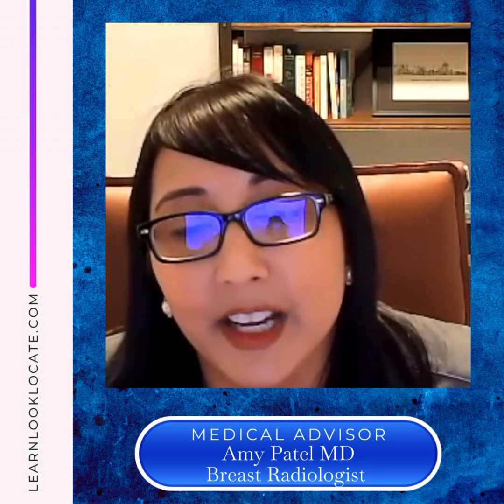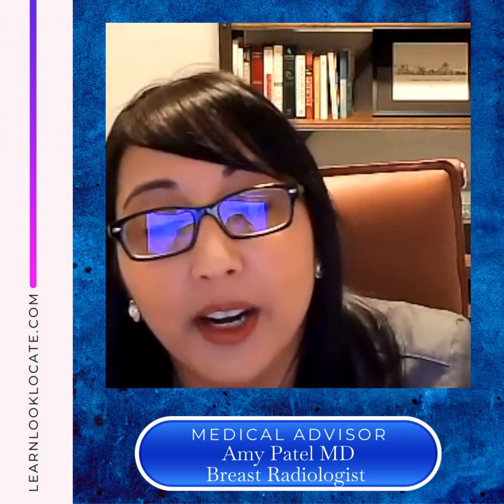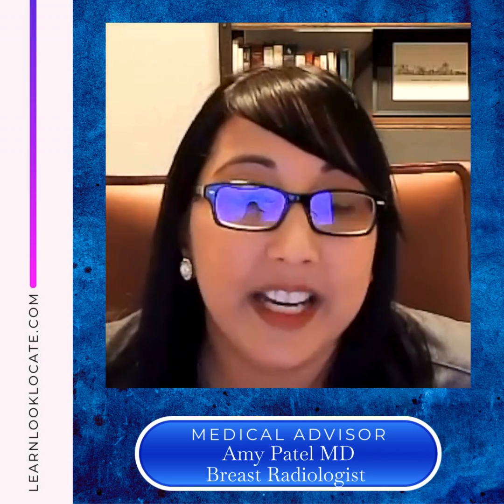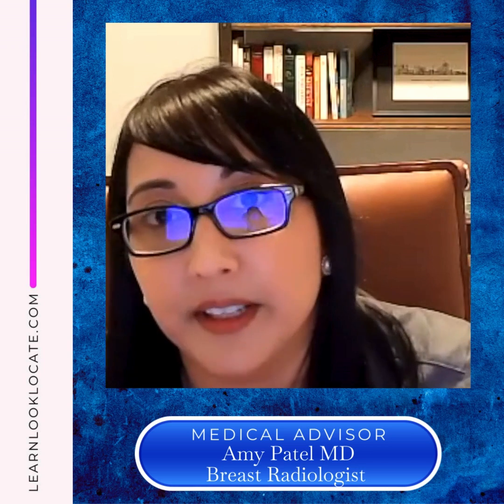warrant additional testing. We need to look for calcifications particularly behind the nipple, where we can have nipple diseases, things such as Paget's disease. We can have things such as DCIS, which is ductal carcinoma in situ, which is thought to be a pre-invasive malignancy that arises from the milk duct of a breast. So we look for all of these things in the breast, and if there's anything there that warrants our suspicion, we need to thoroughly investigate it further.